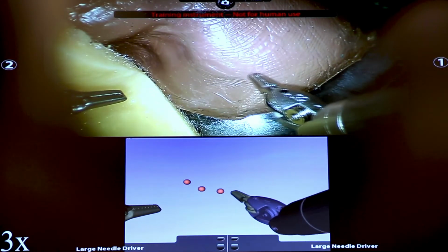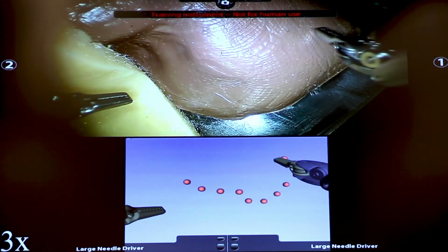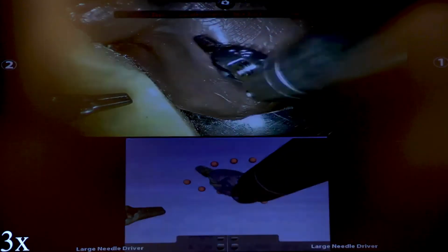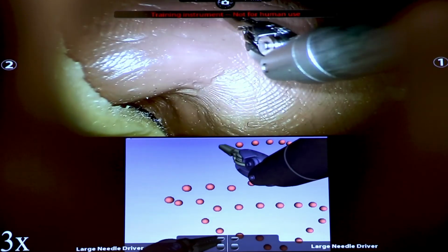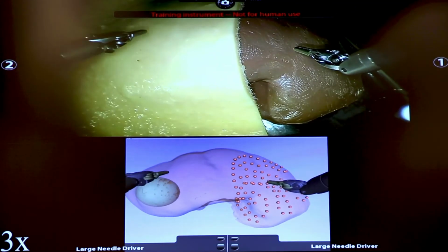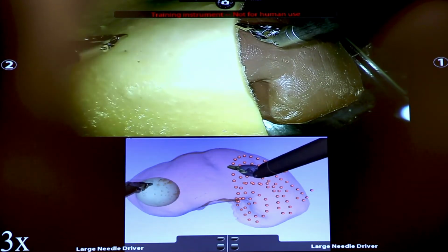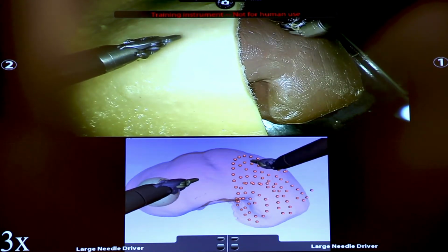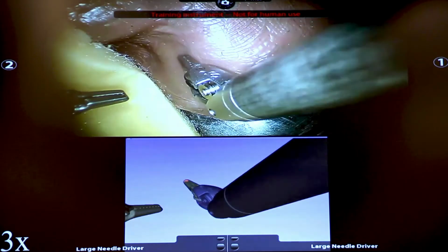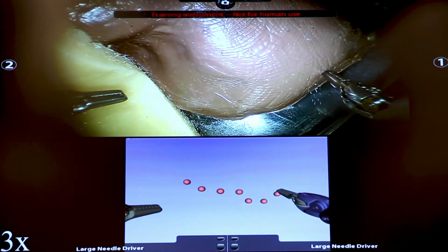This is a video of the actual experiment. You can see here Dr. Cavusi gently tracing along the surface of our phantom, continuing to trace here. And now, after the registration, as you can see, the software can visualize the manipulators and their location relative to the target anatomy, and now the surgeon can see that tumor that's under the surface through the fat.